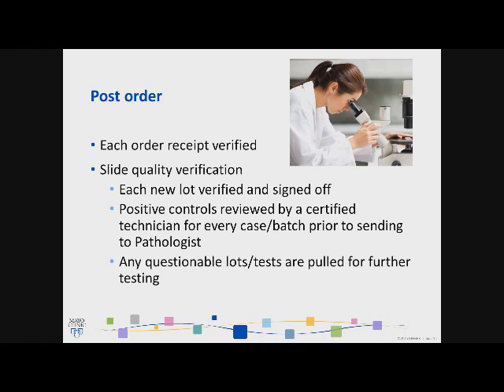We've really come a long way with these issues, and the quality of our immunostains and special stains is very superb. I do say that because I used to be in charge of special stains and immunostains. There are a couple cases where they do batch their special stains and immunostains, but those are few and far between. And any questionable lots or tests are pulled for further testing. They're kind of quarantined over in an area for further testing.